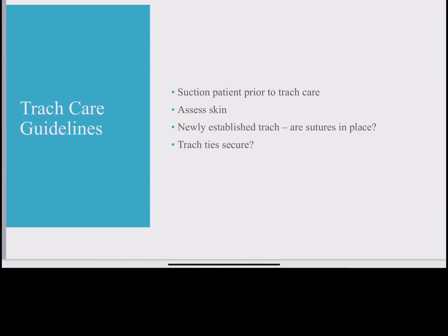So what are our trach care guidelines in our nursing assessment? Well, if you have a trach patient, you're going to, of course, assess at the beginning of each shift. You've got to look and listen to your patients, see if you actually have airflow going through. There are no signs of agitation or irritability. Vital signs and pulse oximetry, oxygenation and humidity. And you need to know if your patient needs the head of the bed elevated to 30 or 40 degrees.